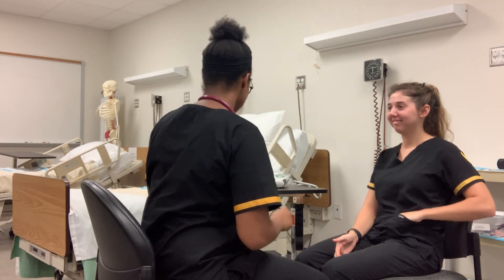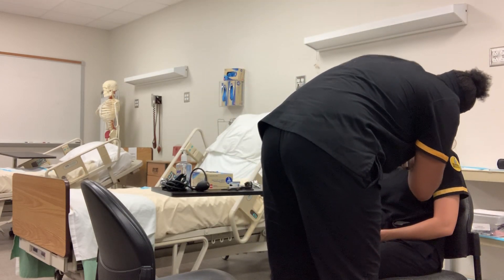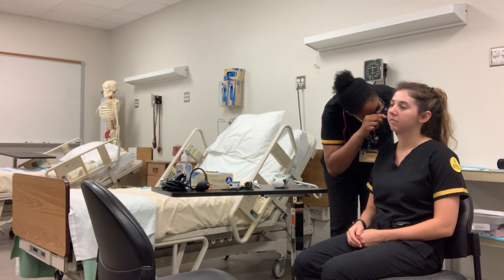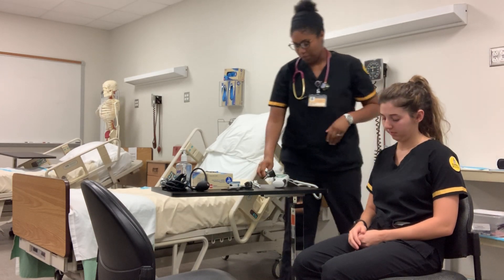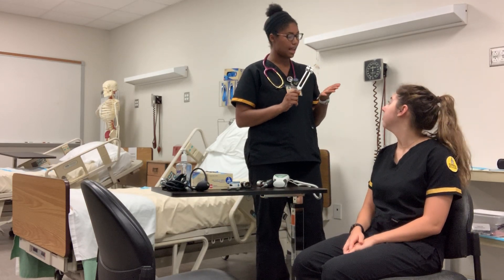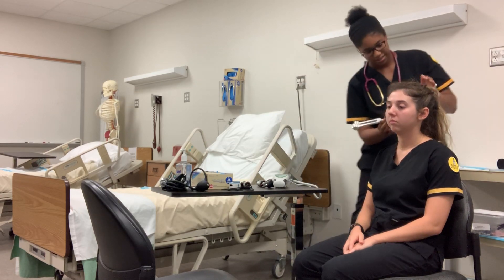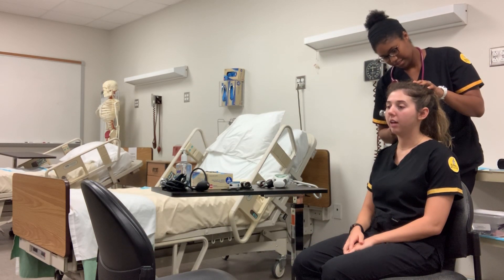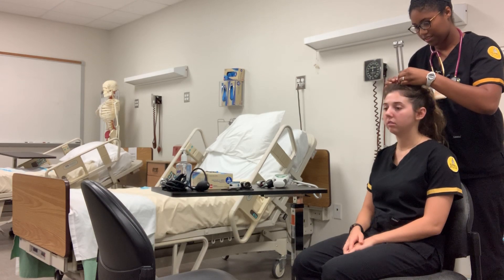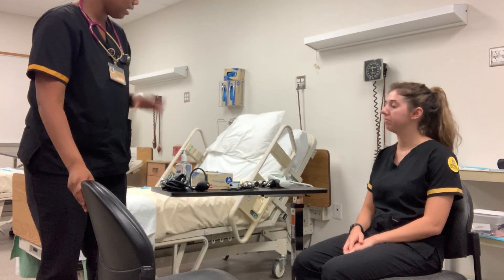Now I'm going to check your ears. I'm going to pull up and out. I see no redness inside, no swelling, no inflammation. The tympanic membrane is a nice pearly white color. I'm going to assess her hearing with a tuning fork. I'll tap it and place the vibration against your ears, forehead, and top of your head. If you hear the sound, let me know. The patient hears at all positions — no hearing abnormalities. Have you been having any problems with hearing? No. No difficulties? That's good.